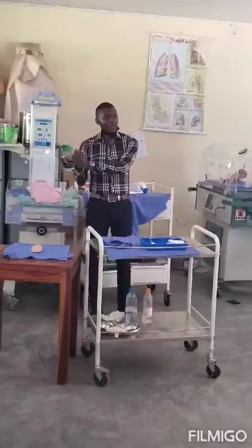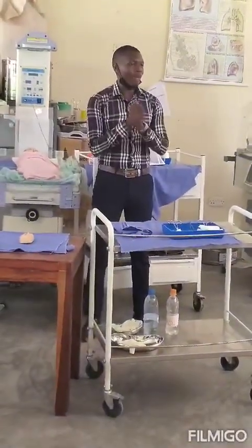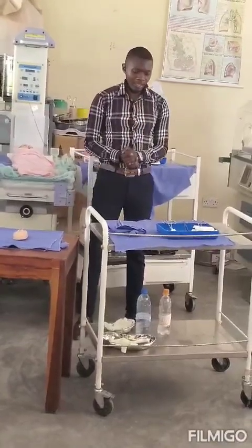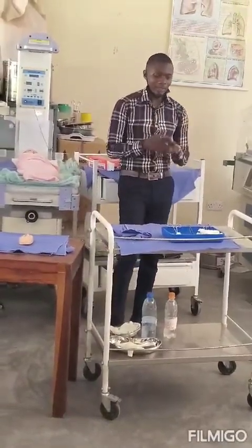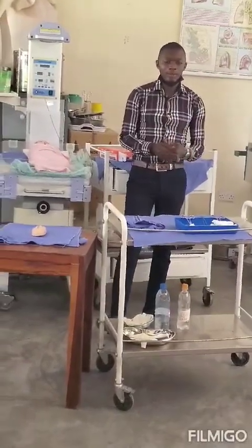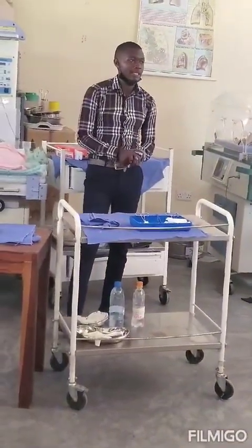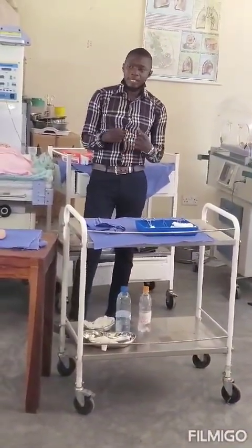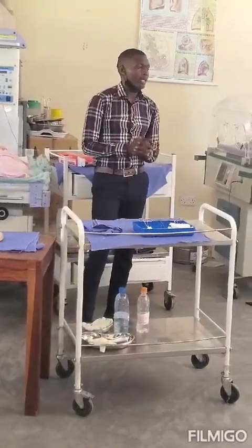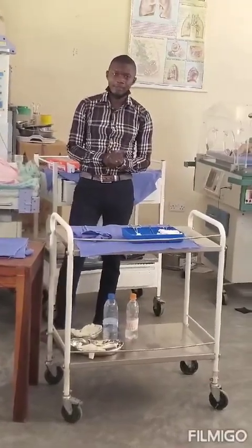So I have gotten permission, I have assessed my patient. The third thing is to prepare what I need to use. So on preparation, if you look at this procedure, the only thing I'm doing is to pour the normal saline on top because the rest has already been done for me, and this is the stage where you find your station at. Suturing is known as a non-touch sterile procedure, so there will be no sterile gloves given because they want to see how you are using the forceps.